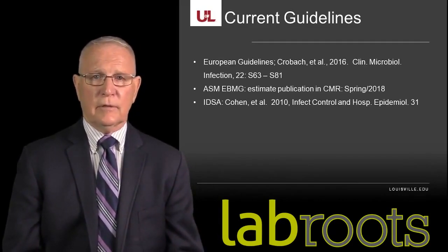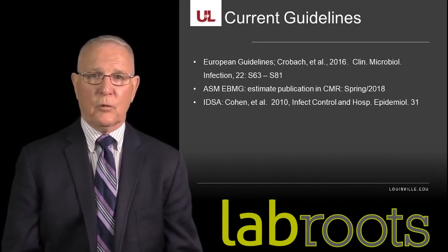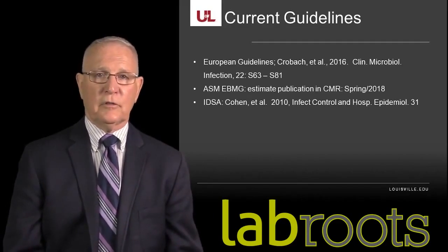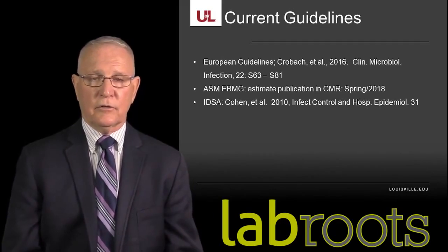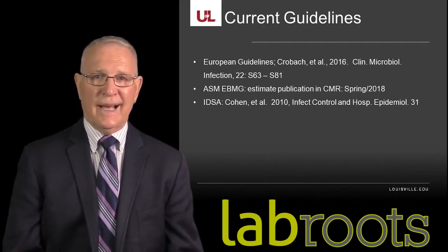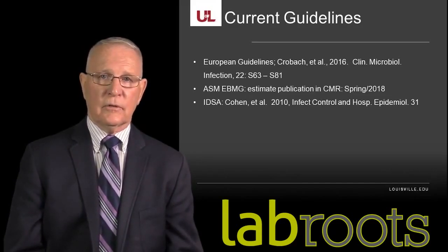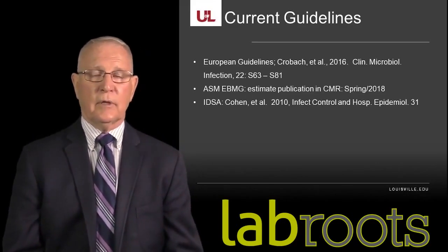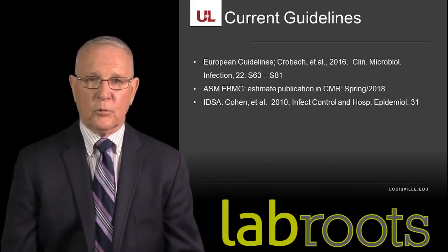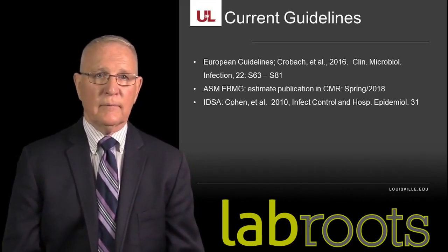I should mention that the American Society for Microbiology is in the final stages of writing an evidence-based guideline on C. difficile testing. The focus is primarily on diagnostic accuracy of the algorithmic approach versus, or along with, the direct PCR. We anticipate that publication to be in print by early to mid-spring.